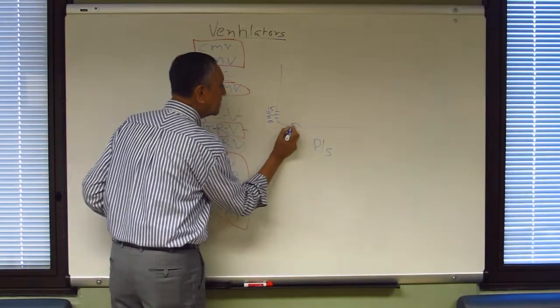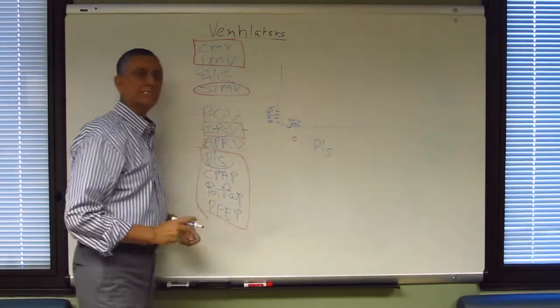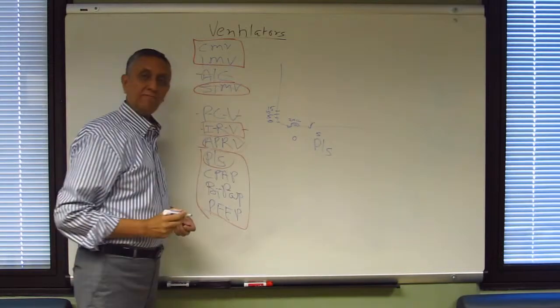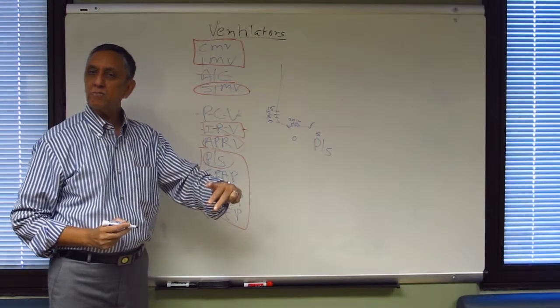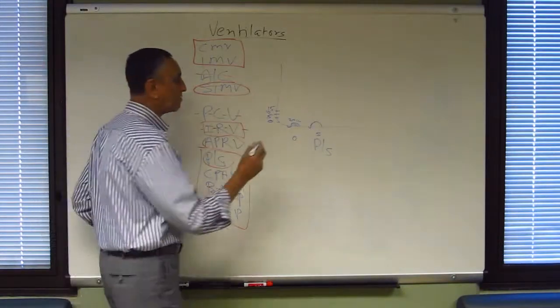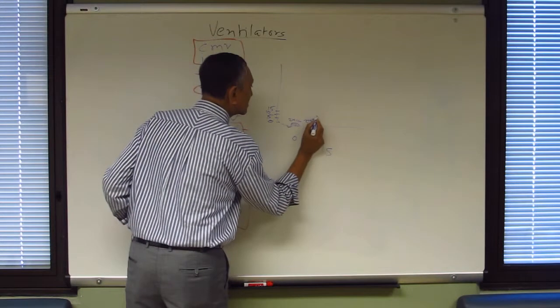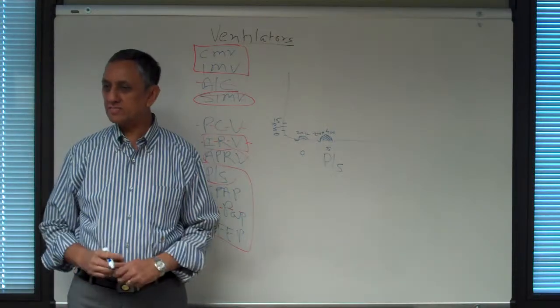The patient initiates the breath, and then this is the breath that the patient is taking, 200 cc's. There's zero pressure support. Now you add 5 of pressure support. So now what happens is, I believe, the moment they have taken their breath and are ready to expire, pressure support kicks in and gives additional air, additional tidal volume. And this is how it looks. So this is the 200 original, and then this is the additional from the pressure support. Let's say that's 400. Now, a few hours later, the patient can take 500 cc's of tidal.